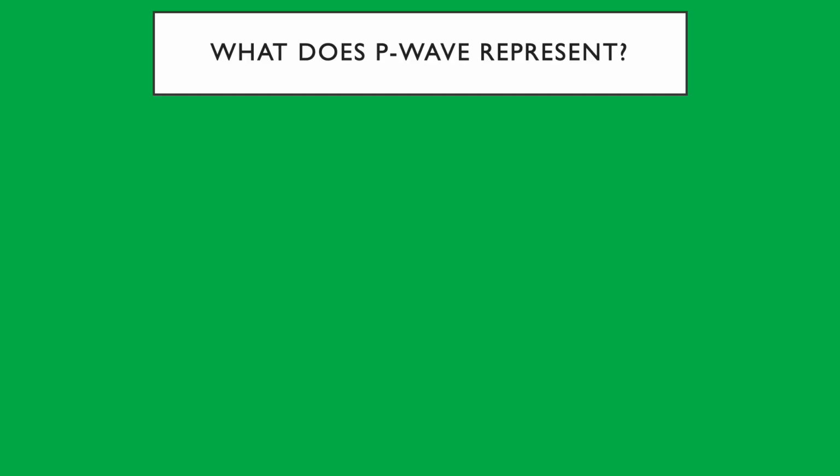Okay, what does the P wave represent? P waves? Depolarization. Okay, which atria, left or right? Right. Only the right. So where is the left depolarization? Left atrial depolarization is which wave? I know I'm confusing you. Okay, so P wave is depolarization of what?